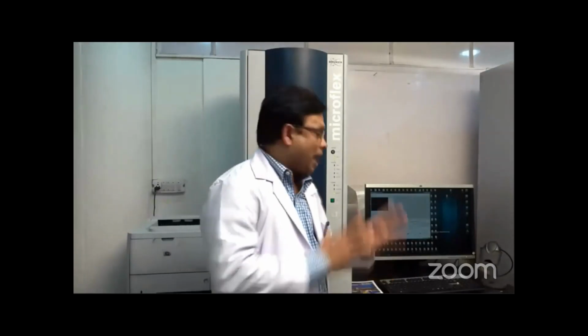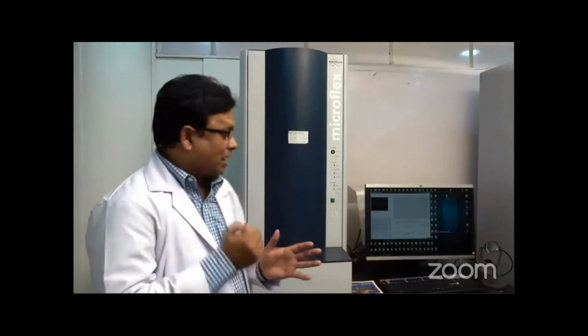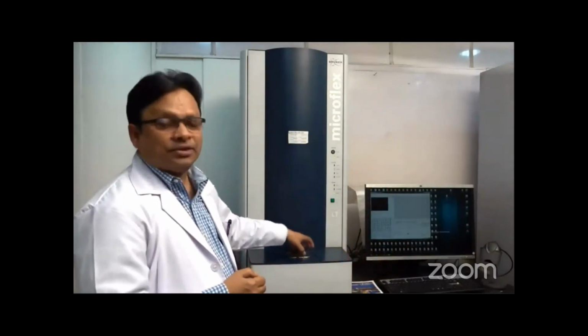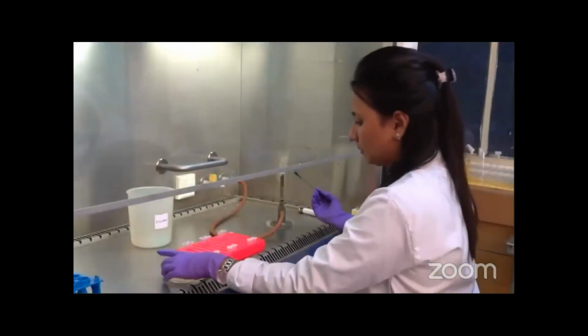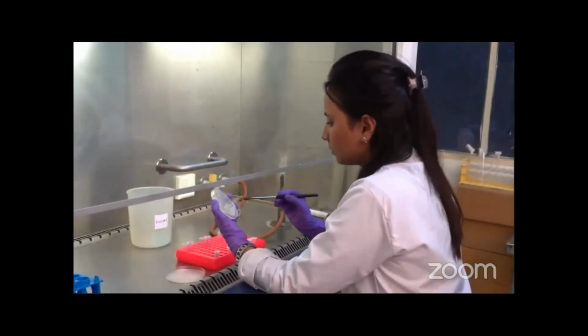We are going to show step by step how we can extract the protein, how we can spot it onto the MALDI plate, then put it into the machine, and how we can use this machine to identify the clinically important fungi. Now we show here the identification of yeast by MALDI-TOF.